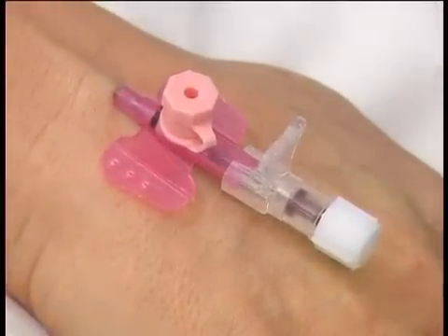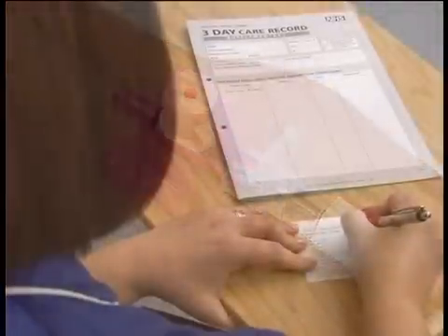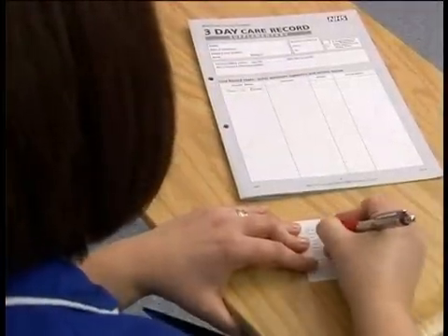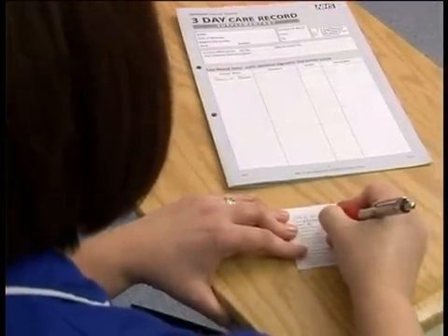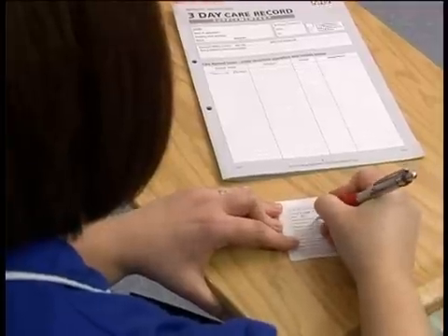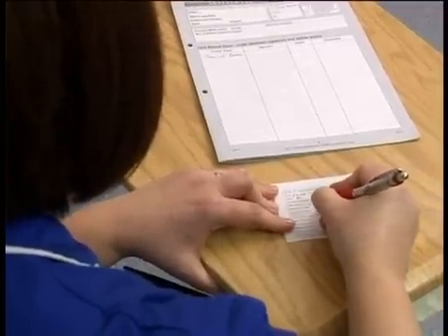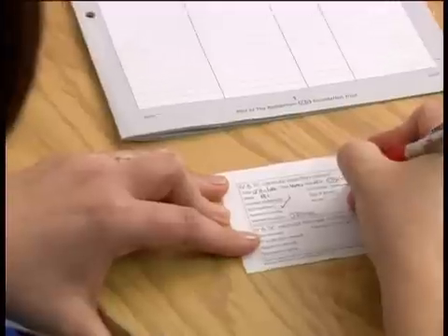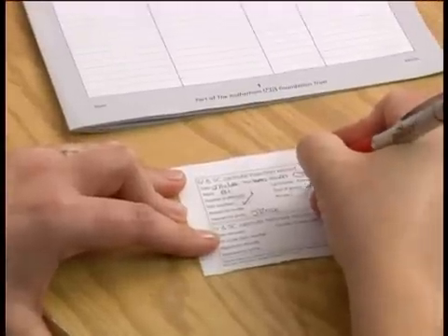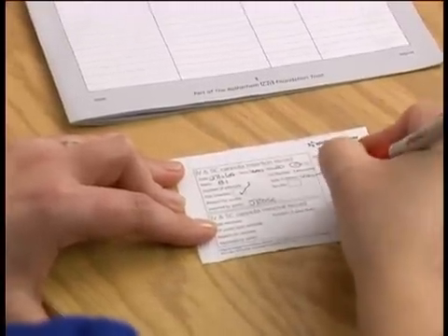One particular aspect of IV care that is often overlooked is the monitoring and documentation related to the condition of the patient's cannula site. Why is it important to monitor cannula sites? This question is best answered by looking at a few photographs of IV sites that have gone wrong.